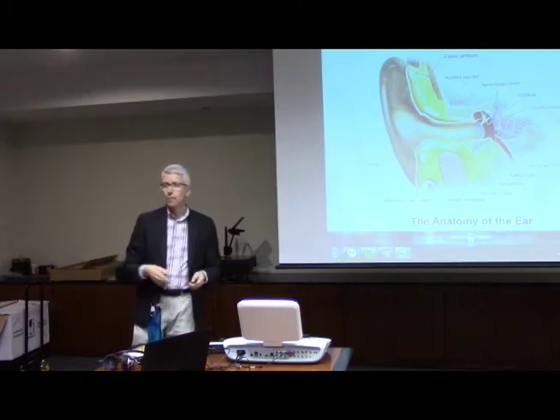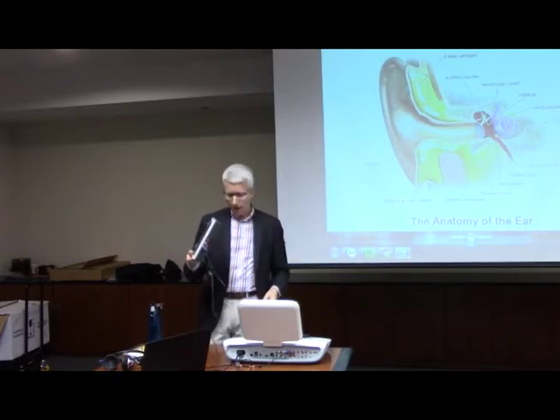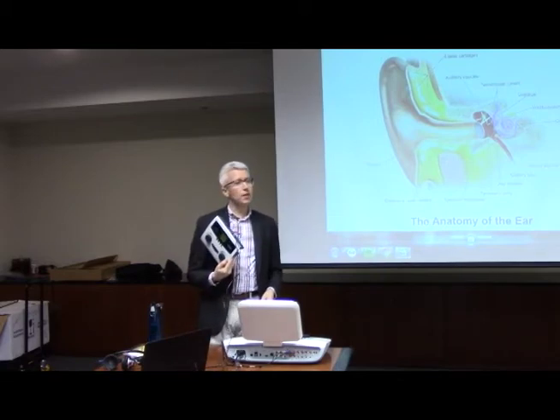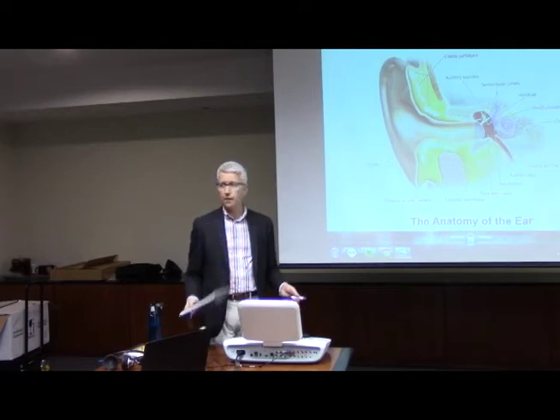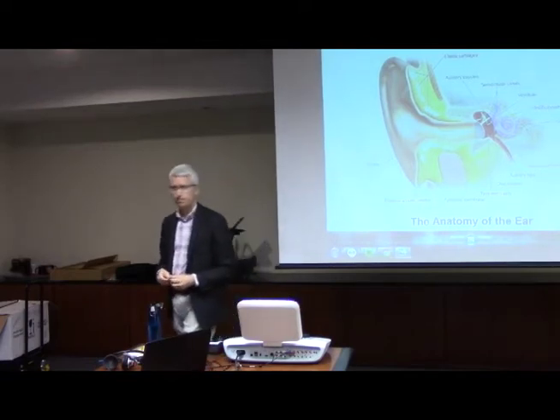Is that what schools use? Yes, schools, perfect example. Thank you. That's an even better example. So yes, schools are going to use this because they're going to test kids, find out can they hear, and if not, send in somebody who can tell more about why.